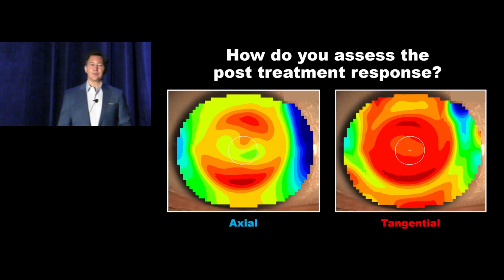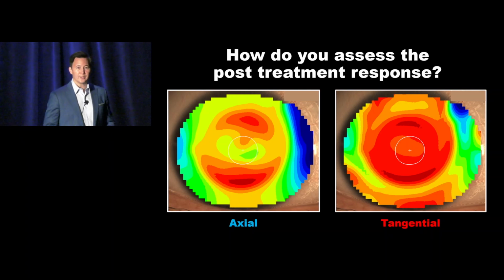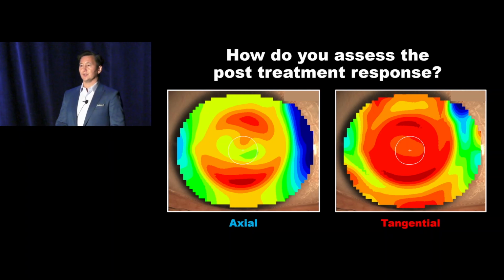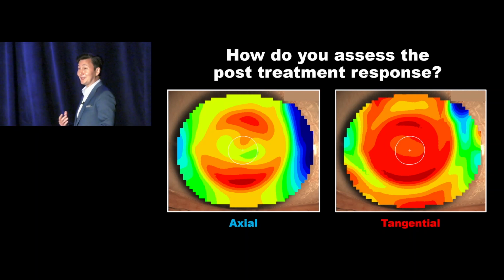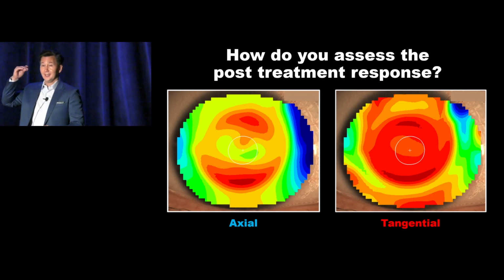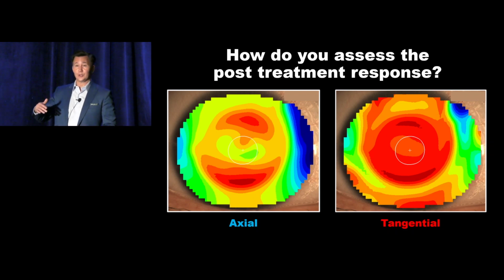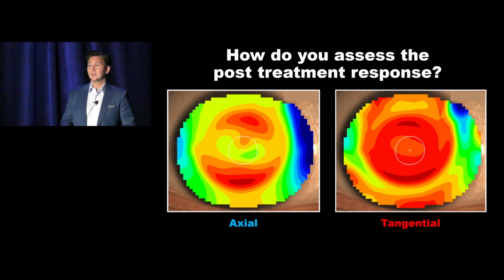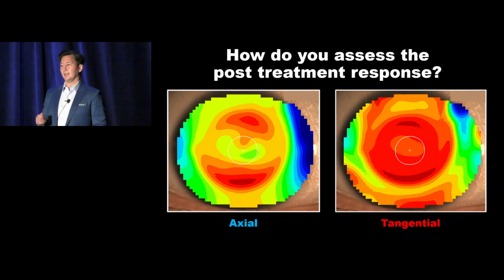Okay, now you've got this brand new topographer. It assesses the topography, the data, numerous different ways. And if you were like me, you were maybe very intimidated by what the instrument was giving you. It had all of this information. I can select this analysis, and which one do I use, and why do I use it? It's very confusing. An axial map is for understanding power.